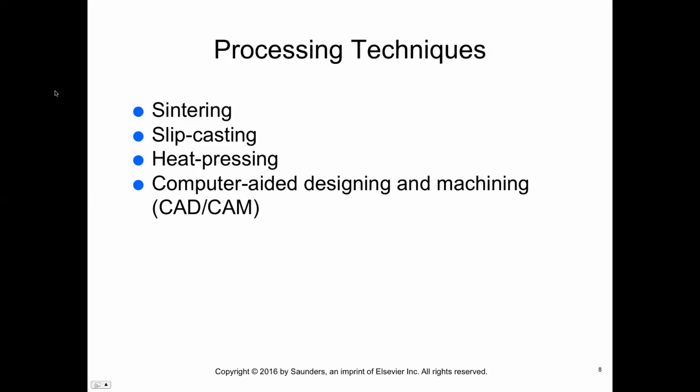Depending on the material used, it may need heat process to complete the firing of the ceramic material. So this is something you guys may see in an office that you end up being in. The digital technology, digital scanners, like I said before, are taking over the need to take the traditional impressions. However, these machines are very, very expensive. Not many offices have them. However, they are becoming more and more affordable.